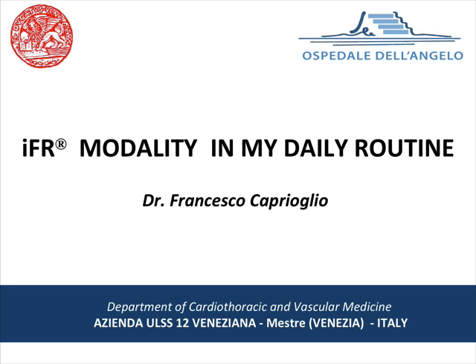I present two clinical cases from our series in which I believe functional assessment of coronary stenosis is particularly useful.